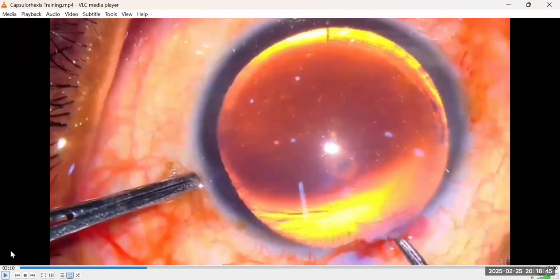So each time any instrument is going back into the eye, one is advised to reform the anterior chamber and even over-reform it. How do I know I have overfilled the anterior chamber with viscoelastic solution? I have already stained with trypan blue, so I have my blue surface. If I overfill with viscoelastic solution, the iris will retract itself a little further backwards, and I will have the white beyond the blue. So that's always one way of knowing surgically that you have gotten yourself a good depth.